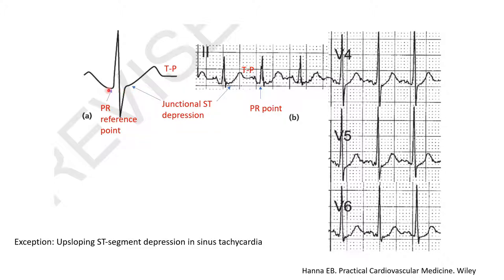Referencing the J point to the PR segment, rather than the TP segment, mitigates the effect of atrial repolarization on the ST segment, as both are affected by atrial repolarization — referencing to PR neutralizes its effect. If you reference to the TP instead, you will end up with a fake ST segment depression purely driven by atrial repolarization. In this example, you have PR depression and junctional upsloping ST segment depression — don't reference to the TP; reference to that PR point.